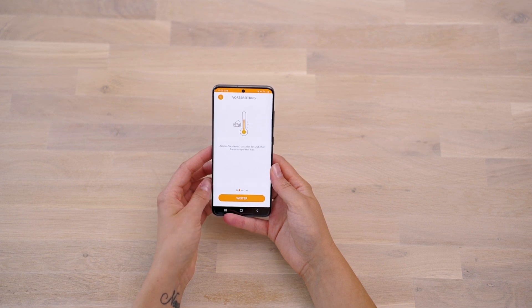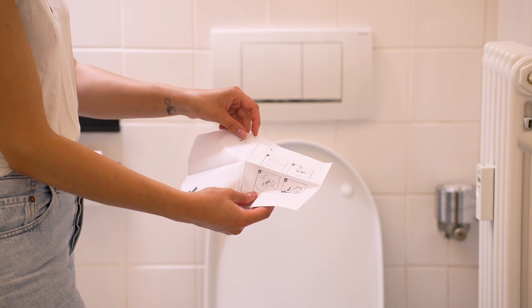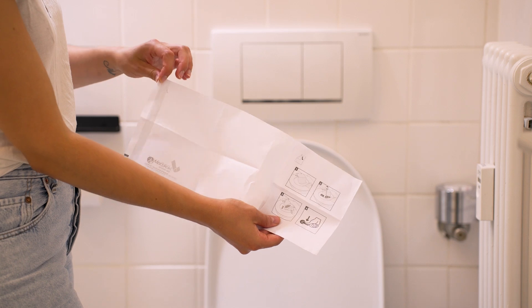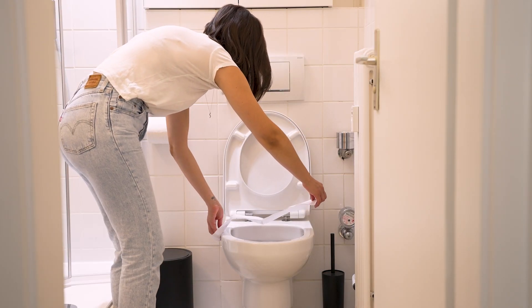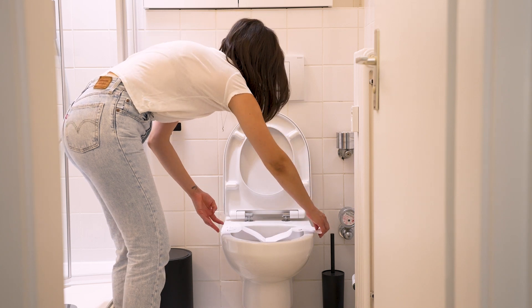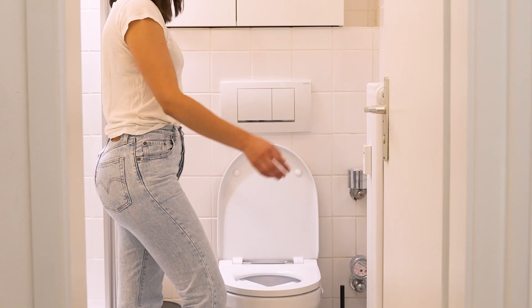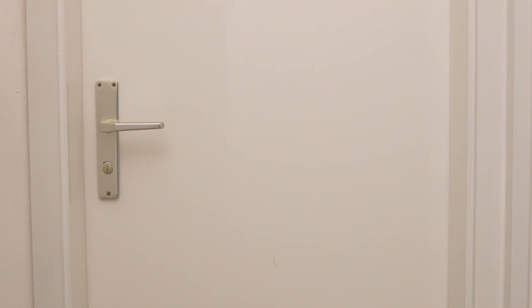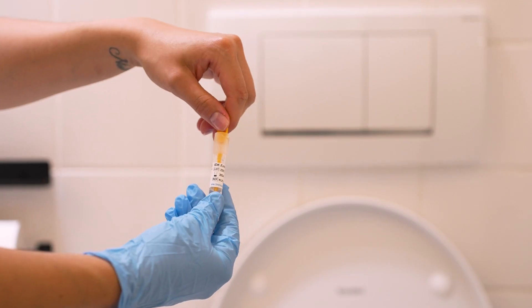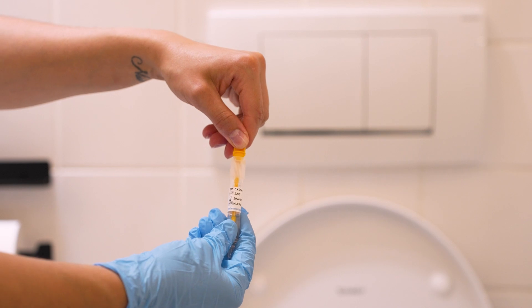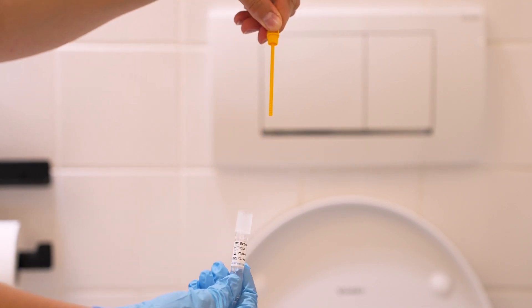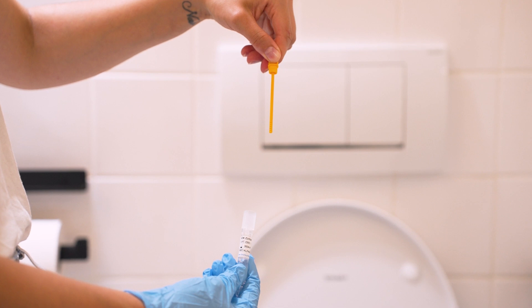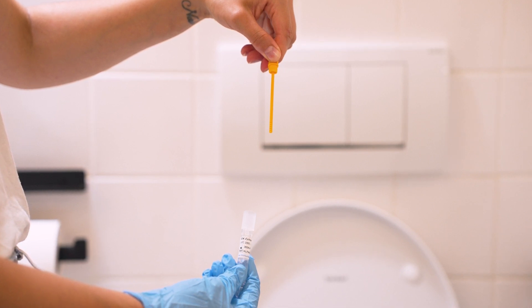Each step is accompanied by the app with animated videos. First, unfold the paper stool collector and carefully pull it apart in the direction of the arrow. Place it in the back half of the toilet and attach it to the sides below the toilet seat with the adhesive strips. Place the stool sample, making sure it does not come into contact with water or urine. Carefully pull the yellow sample collection stick out of the sample collection tube with a slight twist. Hold the tube upright while doing this so that no buffer solution leaks. Be careful with the tip of the sample collection tube so that it does not break.